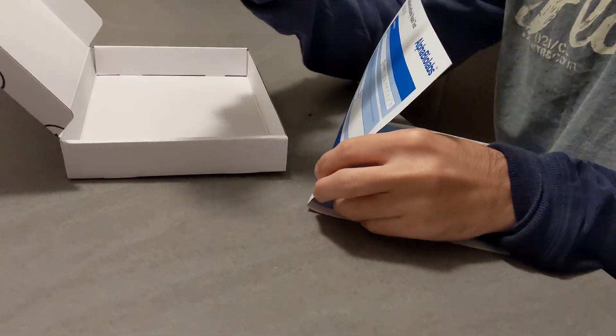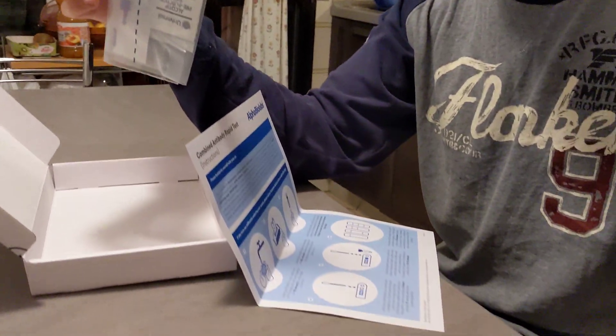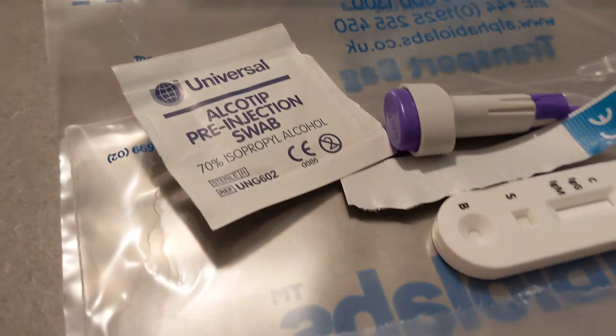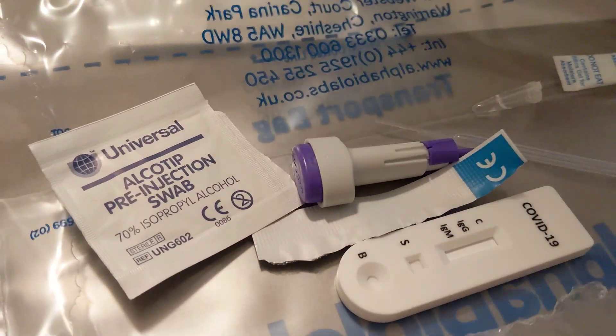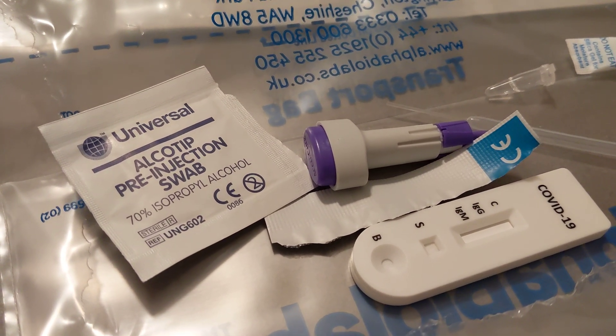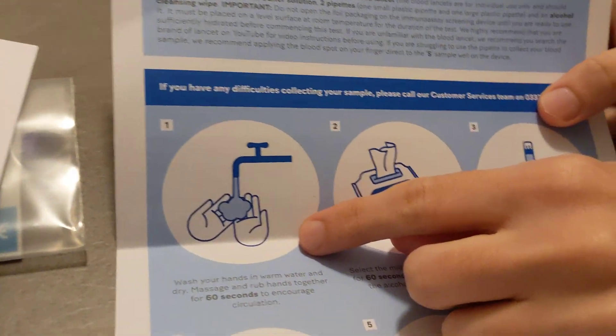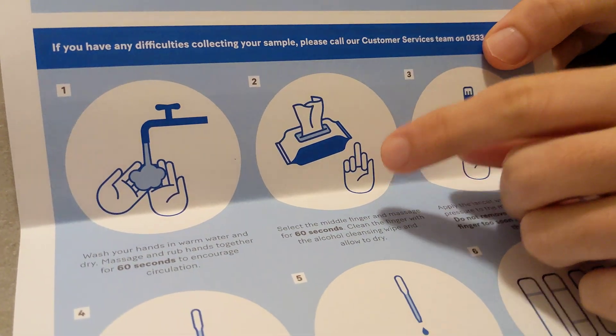Inside you're going to find the kit. I don't want to open a new one — we've already opened another one here. What you find inside with the instructions is, first of all, the instructions say that you're going to wash your hands, which is fine — you should be able to do that.